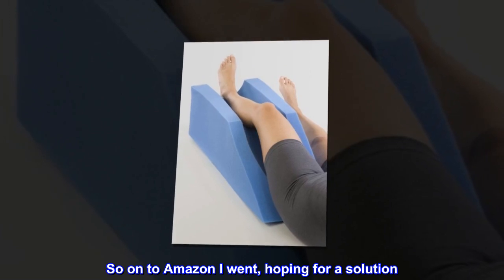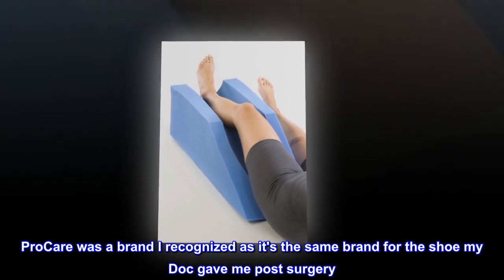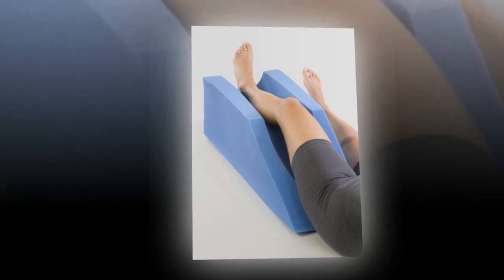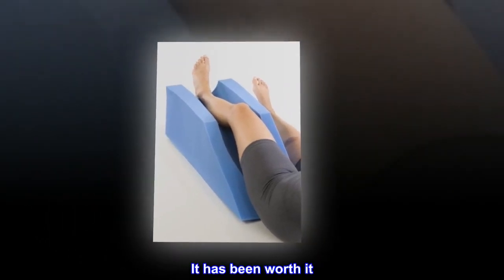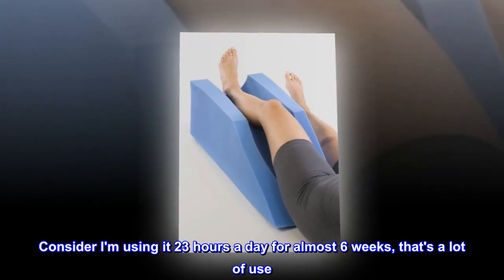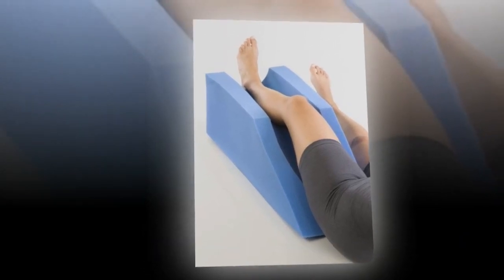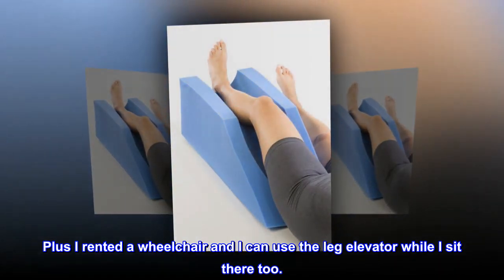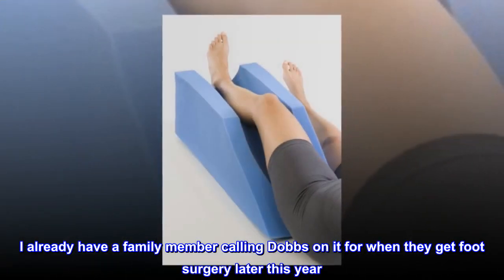So on to Amazon I went, hoping for a solution. ProCare was a brand I recognized as it's the same brand for the shoe my doctor gave me post-surgery. $50 was much more than I wanted to spend, but I did it anyway. It has been worth it. Consider I am using it 23 hours a day for almost six weeks — that's a lot of use. Plus I rented a wheelchair and I can use the leg elevator while I sit there too. I already have a family member calling dibs on it for when they get foot surgery later this year.